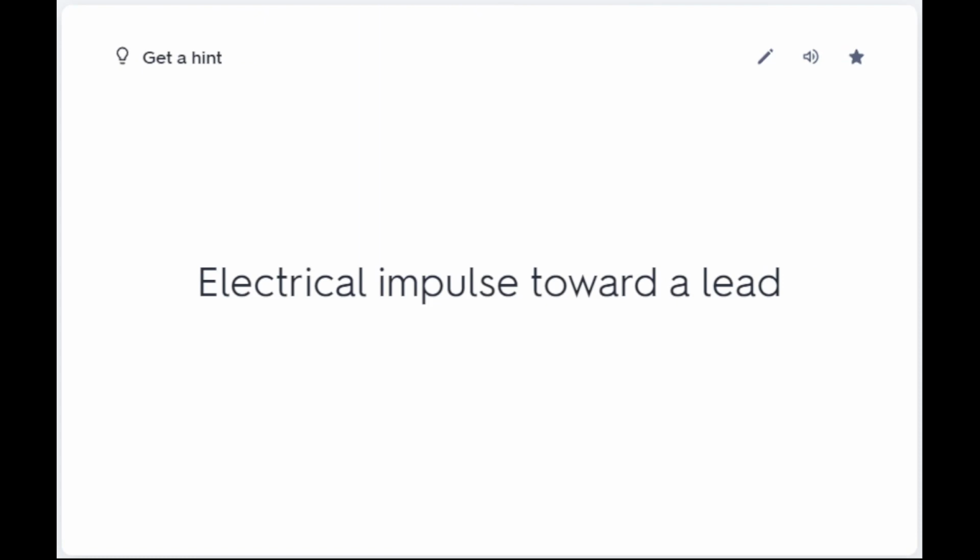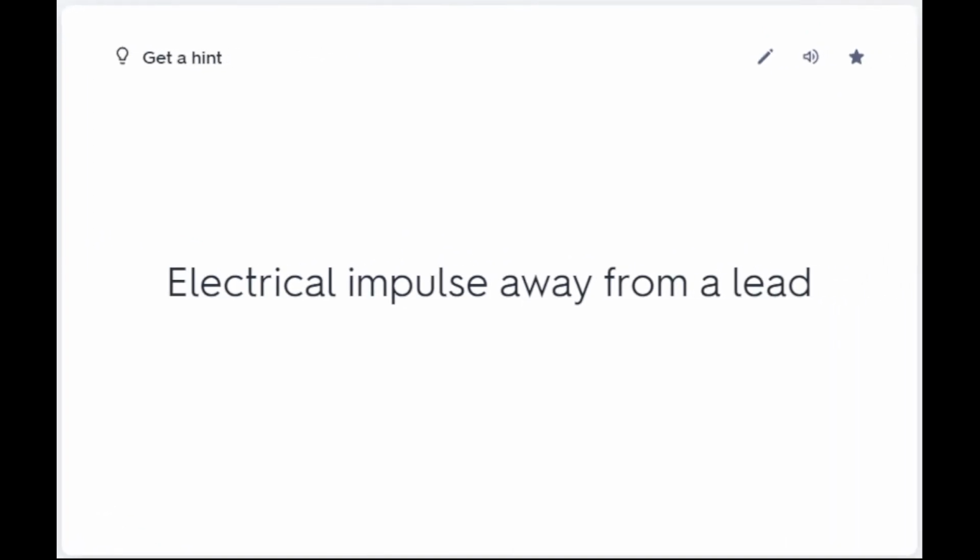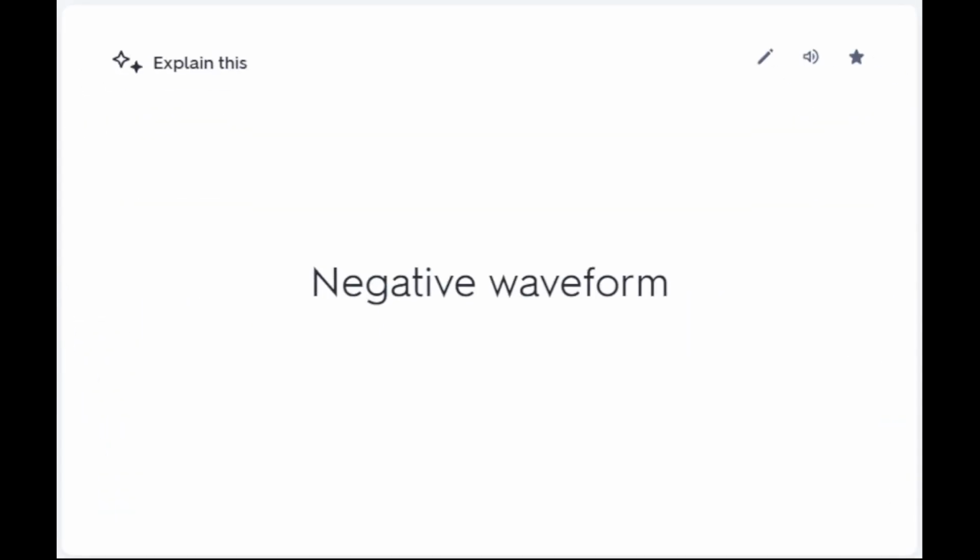Electrical impulse toward a lead: positive waveform. Electrical impulse away from a lead: negative waveform.